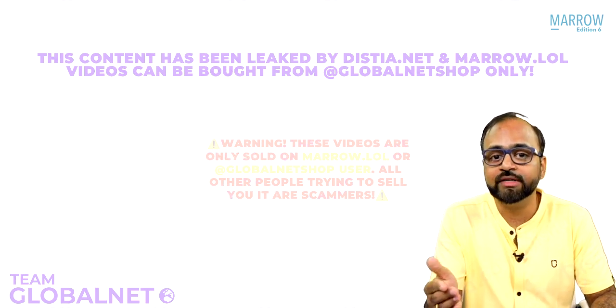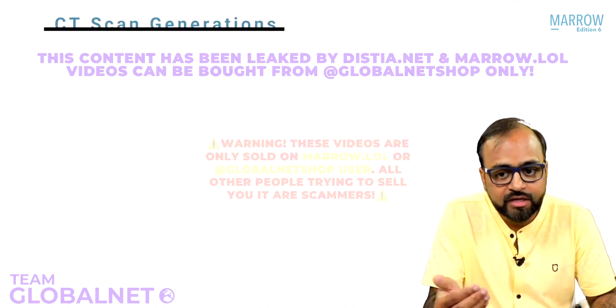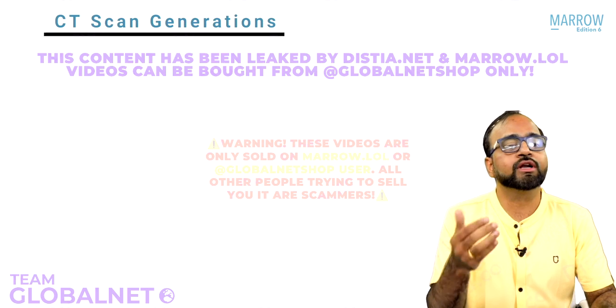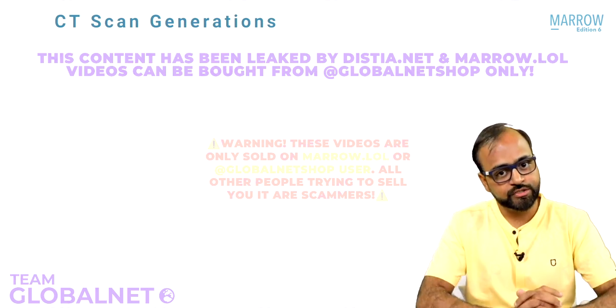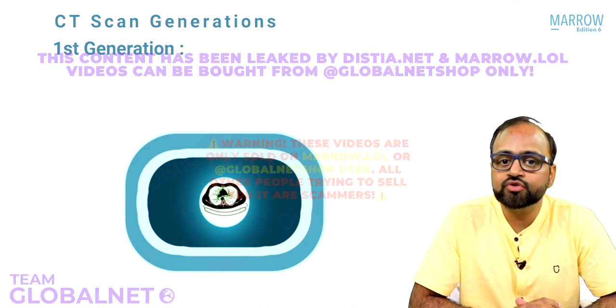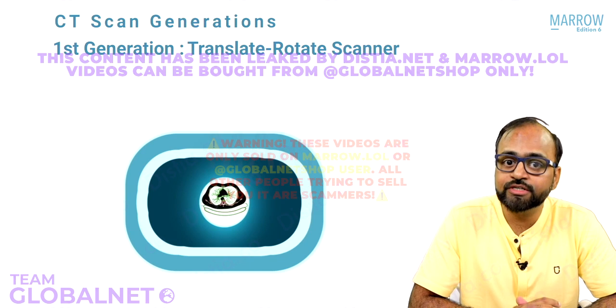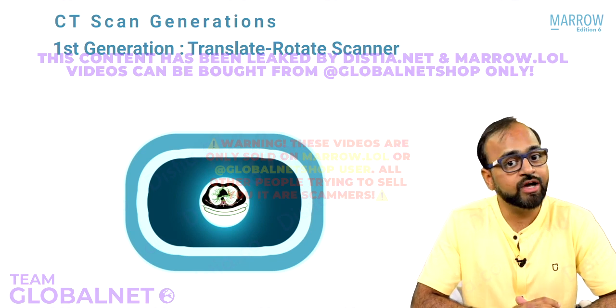Now, over the past many years, there have been several developments in the technology of the CT scan machine. Let us quickly look at, therefore, what are the various CT scan generations. This is the first generation CT scanner machine. It is also called as translate rotate scanner. This was the machine which was first invented by Sir Godfrey Hounsfield.